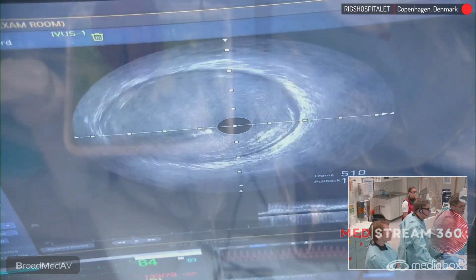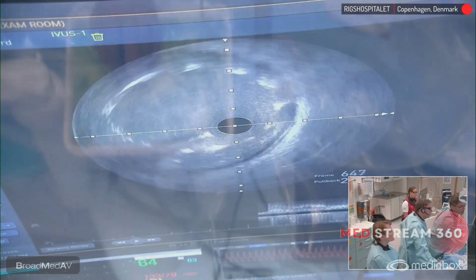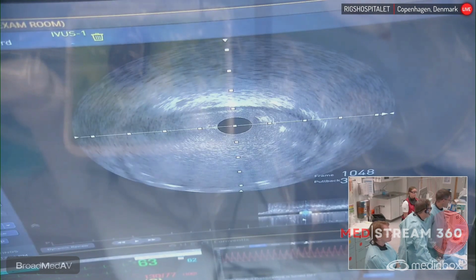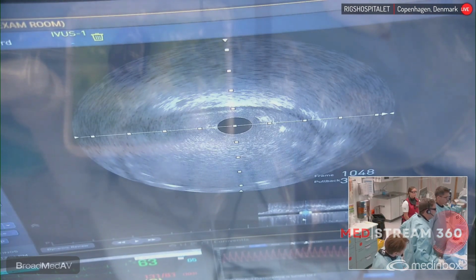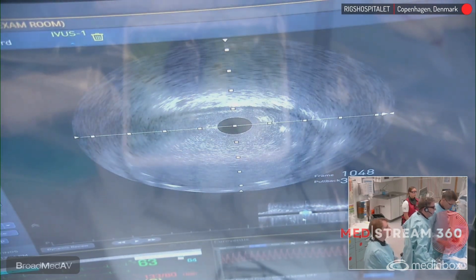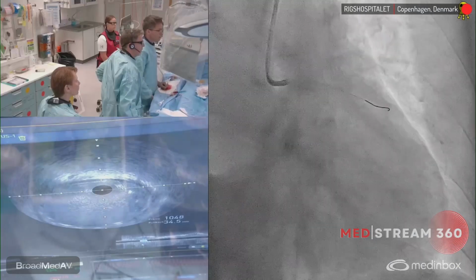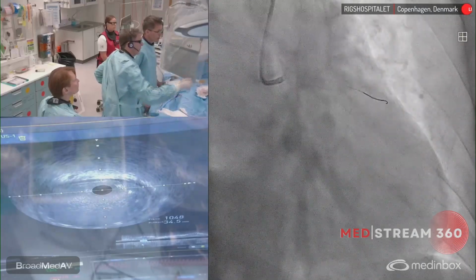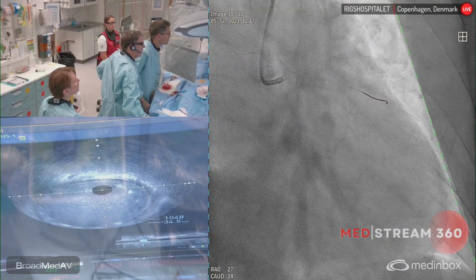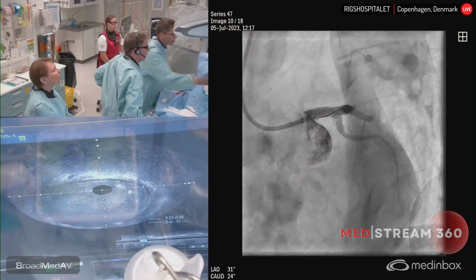No, exactly. And based on that, because on that one we don't see the first diagonal, we only see the second diagonal, so we actually just have to see how it looks here. I don't think you have it here. I think you should go left instead. Yeah, sorry. Maybe there's too much foreshortening, but we'll see. It's too much foreshortening on the first diagonal.